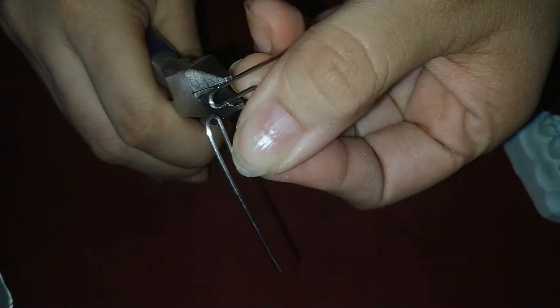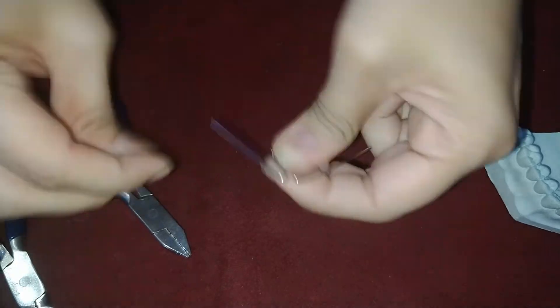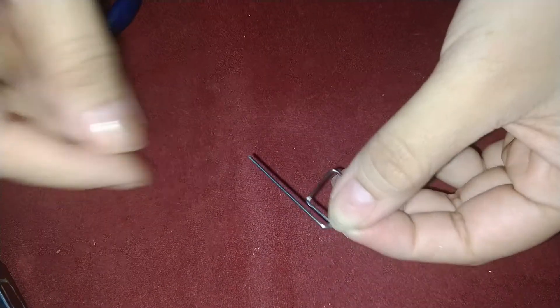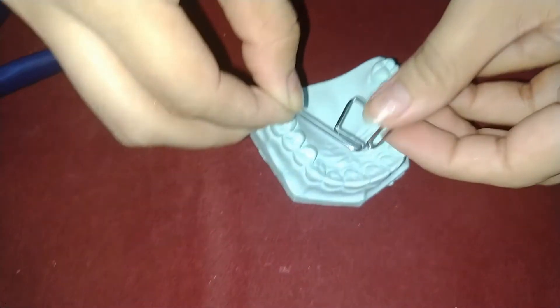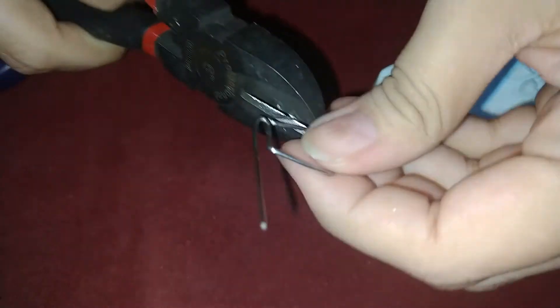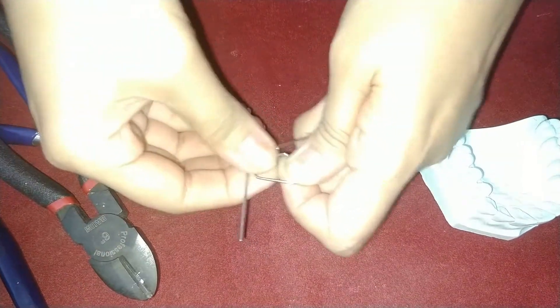Now this retentive arm is too long to adapt to the palatal surface. So with the help of wire cutter, we will be cutting the excess part of this wire. We will do the same thing on the other side.